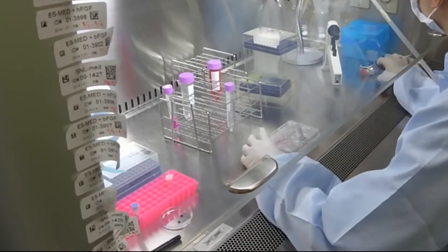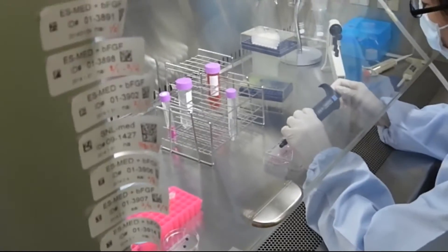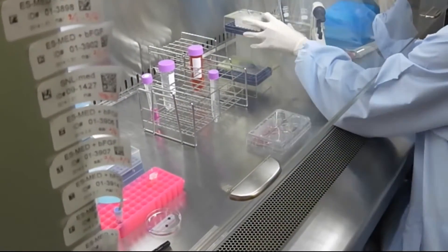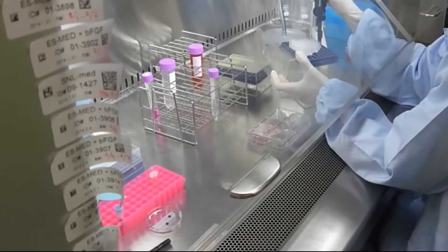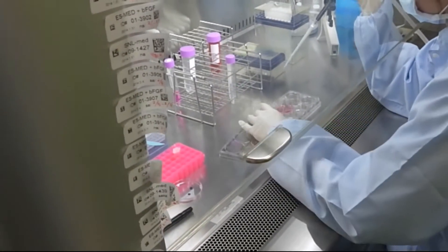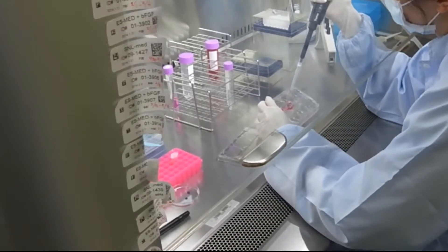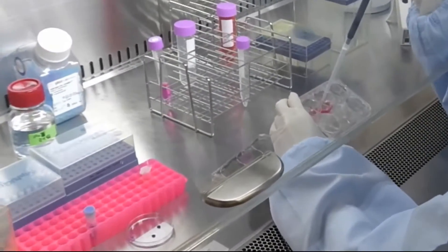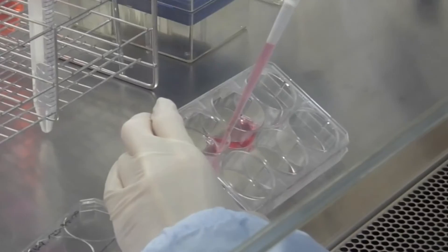0.8 milliliters of mononuclear cell culture medium is transferred into a 1.5 milliliter microtube in advance. The pre-cultured cell suspension of peripheral blood mononuclear cells is collected into a 15 milliliter tube.